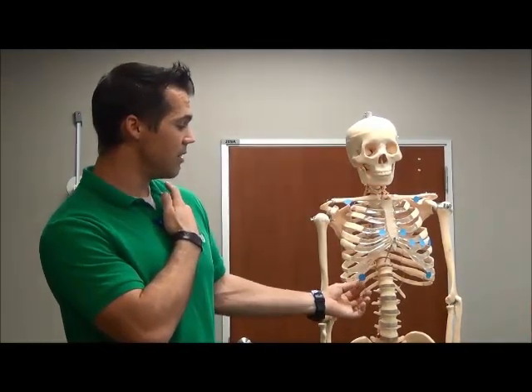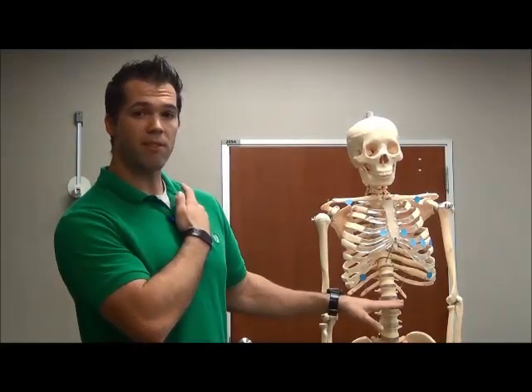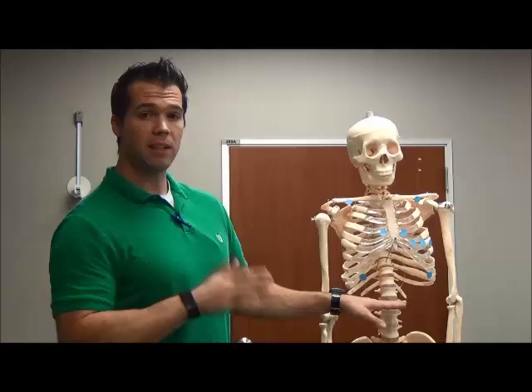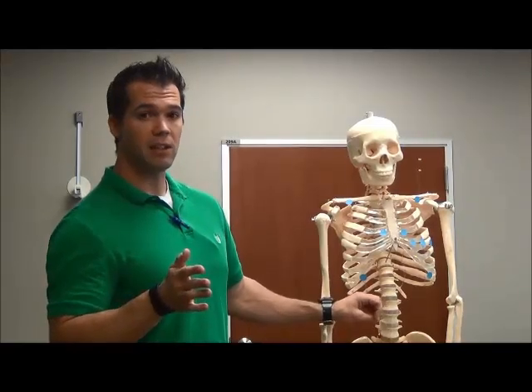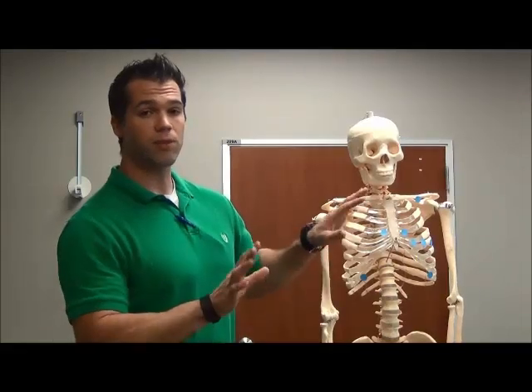Then you have the leg leads. The skeleton doesn't have a belly here, but really this goes right above the belly button. To the right of it would be your right leg. Right above the belly button to the left of it would be your left leg. So those are the four limb leads.